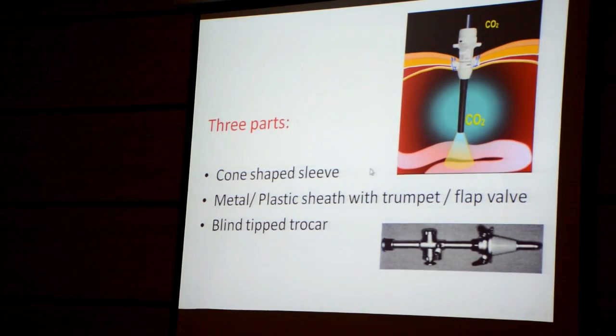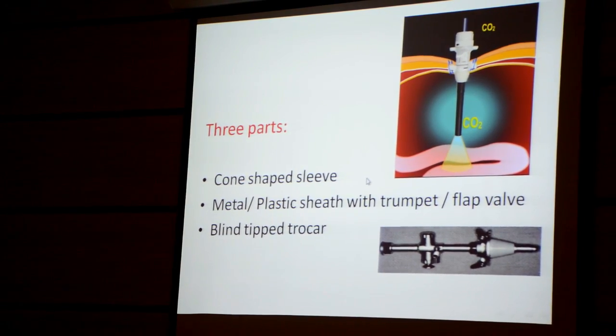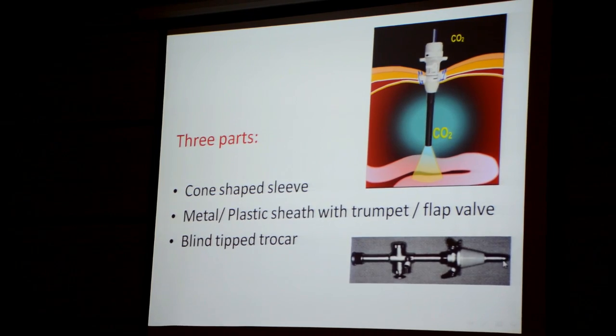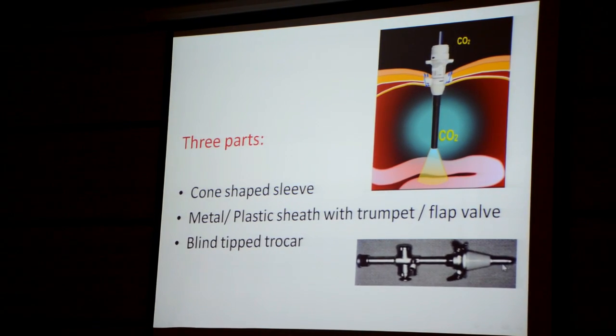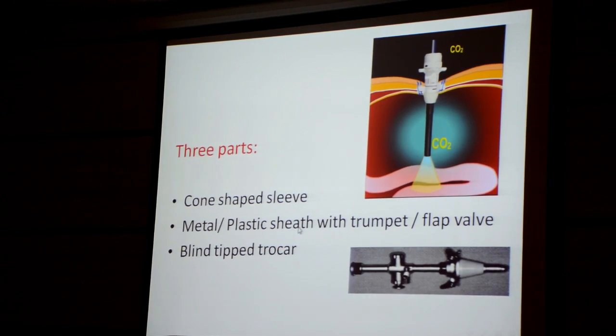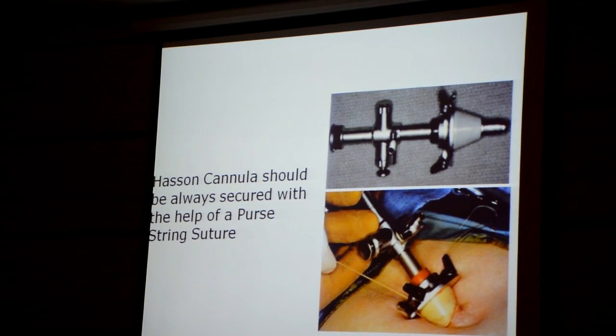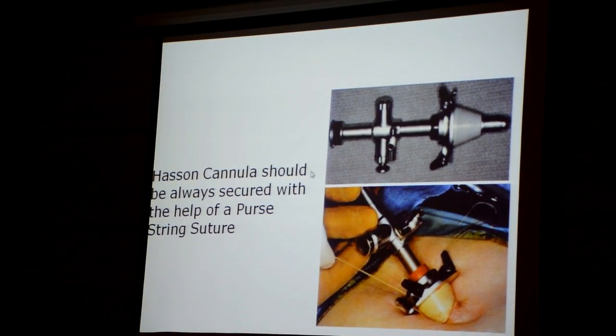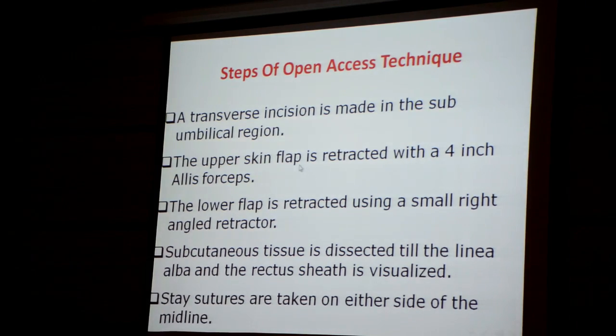You should open the sheath and then enter, because it has a blunt end and can enter safely after opening the wound and the sheath. Inshallah, we will show this technique in the operating room.